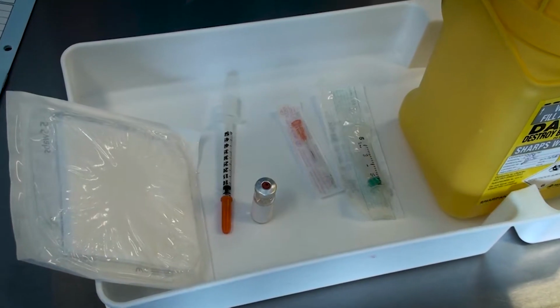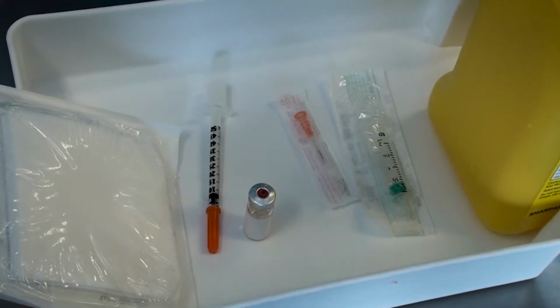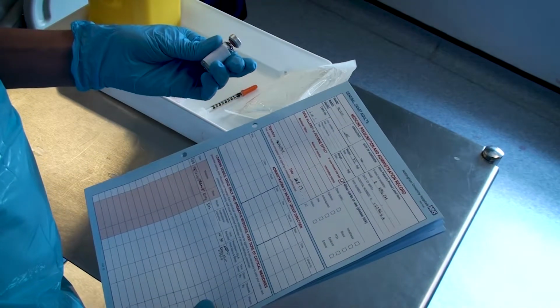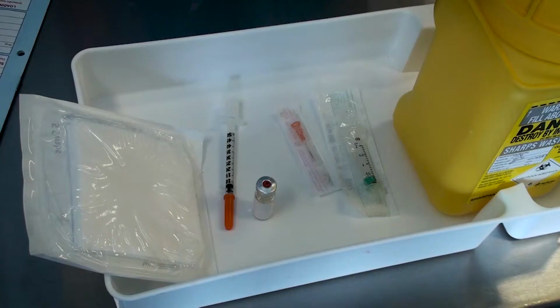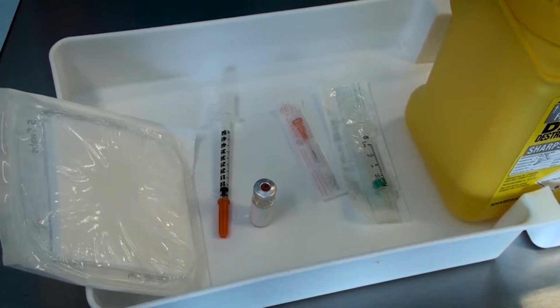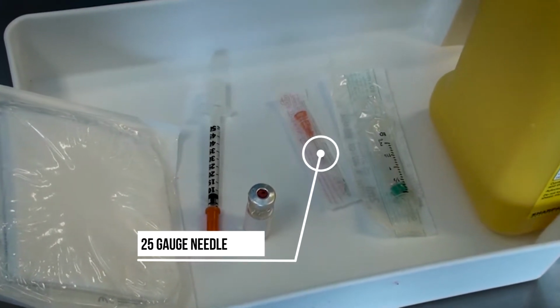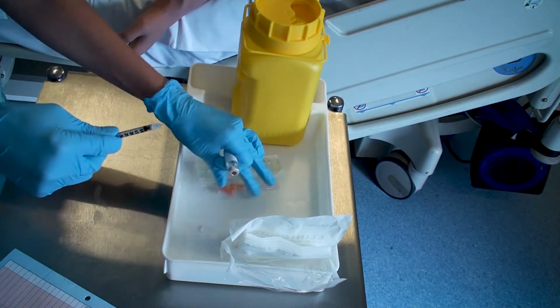You must then assemble the equipment required, ensuring that the tray has been thoroughly cleaned using the appropriate wipes. Confirm that you have the correct drug to be administered, that it's the correct dose, the correct route, and that it is within date. If not using a pre-filled syringe, you will need a 25 gauge needle or orange needle, an appropriate size syringe. Prepare and draw up the appropriate dose of the drug.